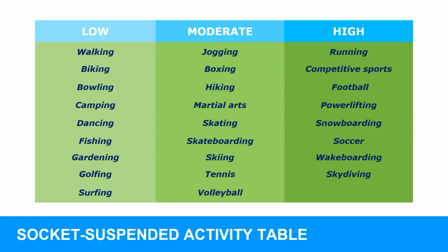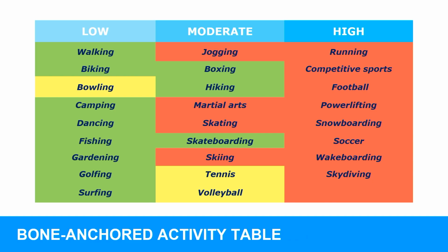After 40 years of fitting limbs in sockets, when a patient comes to me with a desire to do something crazy, I've always said, and I think most of us are like this, why not? Let's try it, including any one of these activities, from low, moderate to high activities. The most difficult thing for me in osseointegration is that now I finally have to say no. High-impact activities are discouraged, and this is really difficult for me.